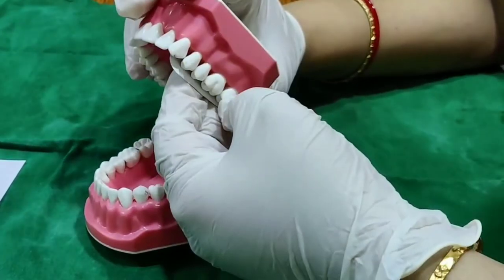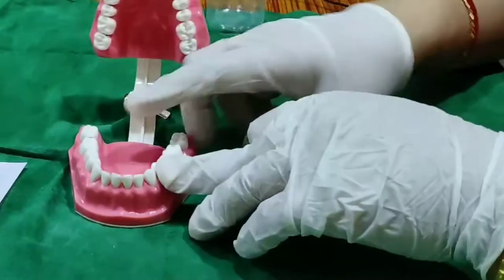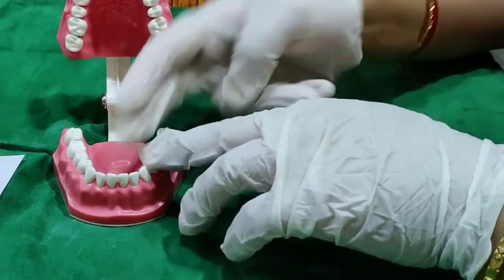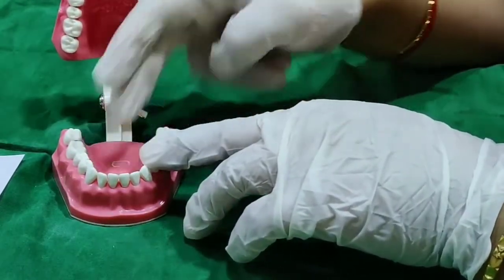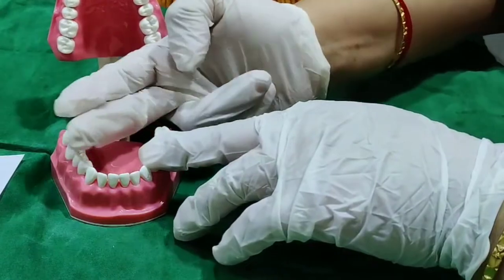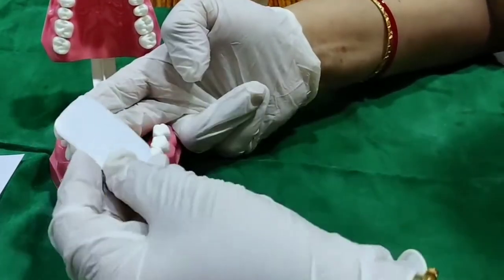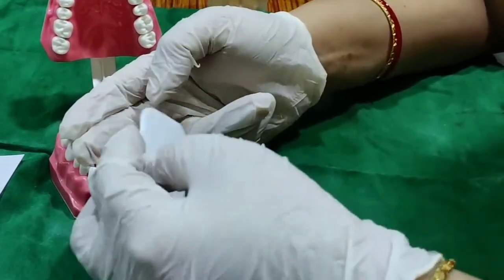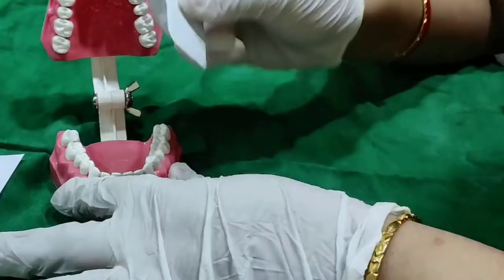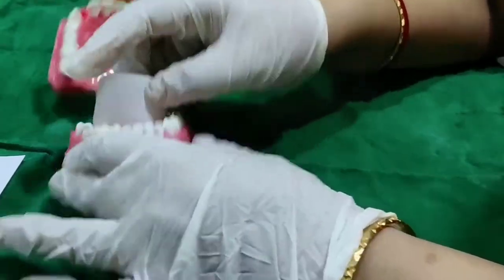For positioning of the maxilla, the same principles apply. For the mandible, since the patient has a tongue, ask the patient to move the tongue to the opposite side and place your film in the sulcus. For the lower arch, the raised dot should be above.